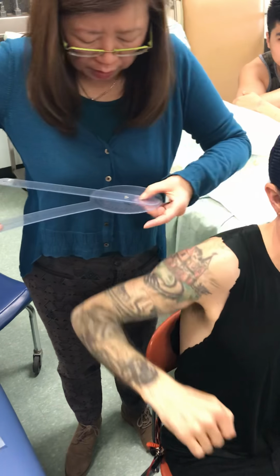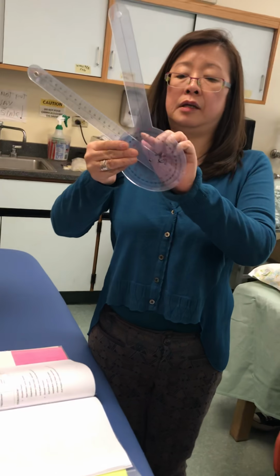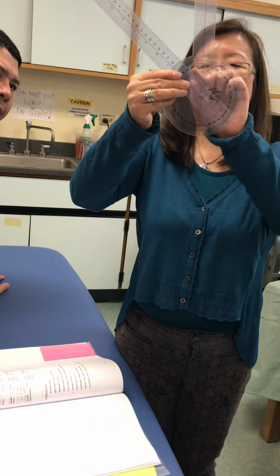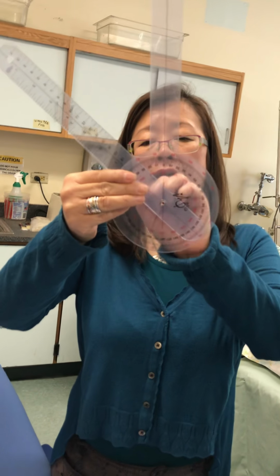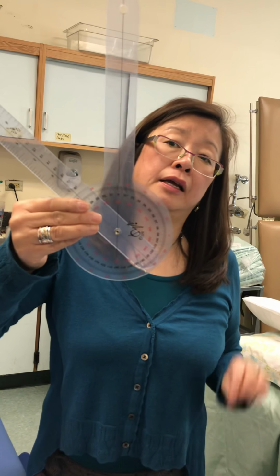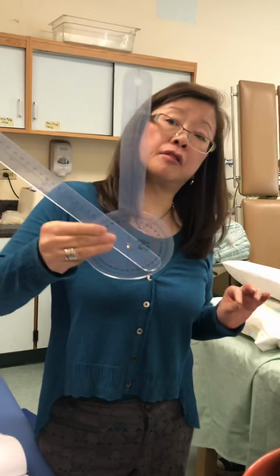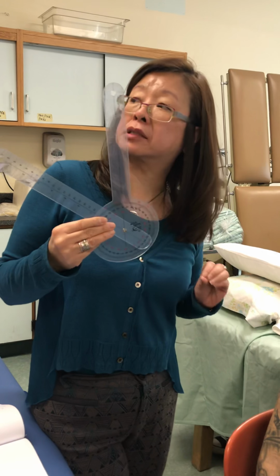Okay, pull it away. Put your arm down. So this was 90. 100, 110, 20, 30, 35, 37. 137. Okay? So he started at 0 to 137. Does that make sense?